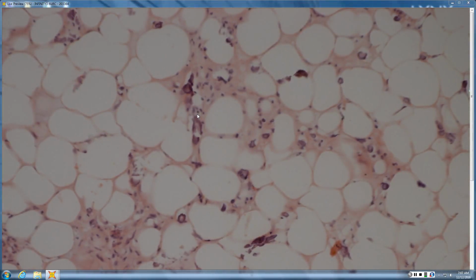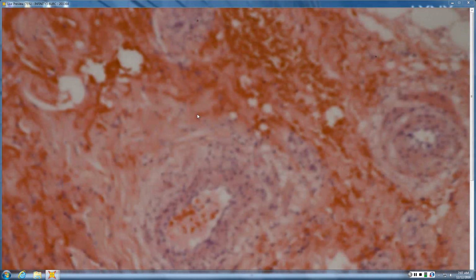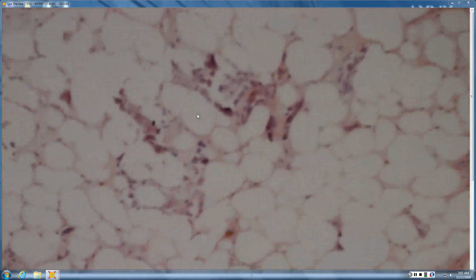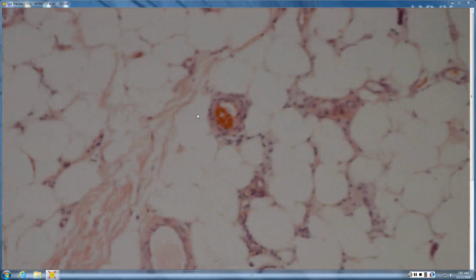So all of these are outlining a lot of the capillaries. But you can see here, it doesn't really ever affect the big vessels, right? So we care about, if you're going to go look for it, you have to go look in the small vessels in the sub-Q. What else do we typically see, which is a nice clue to go along with it?